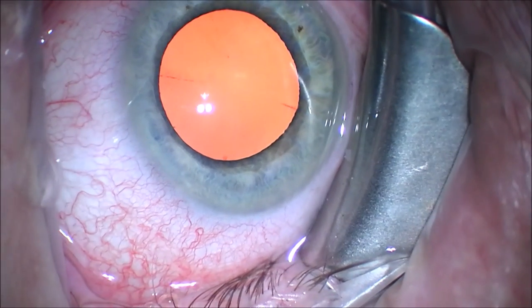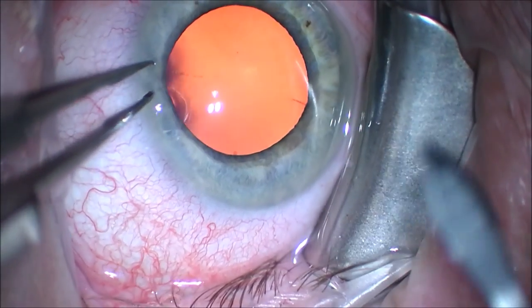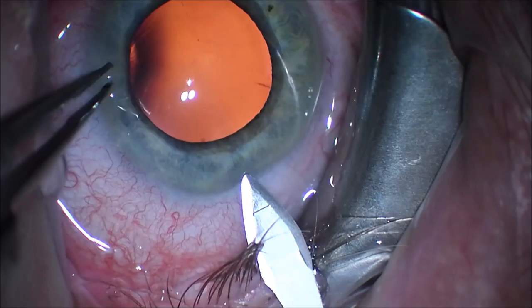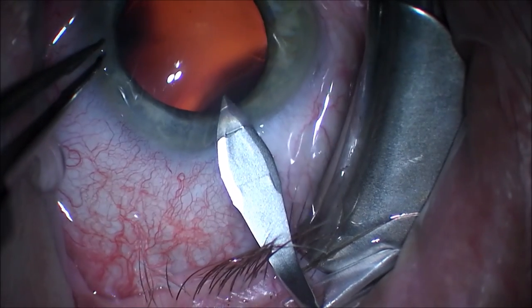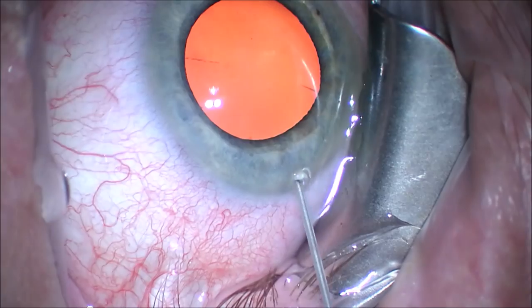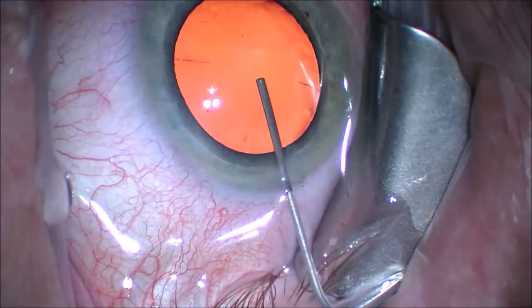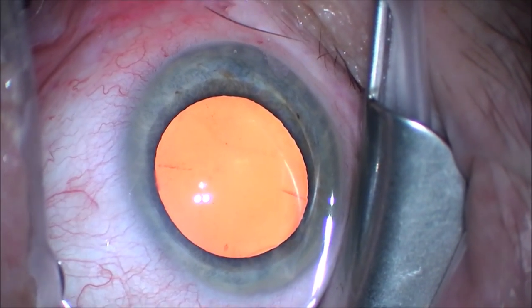You can see we make our typical sideport incision with a MVR type blade. We hold the eye through the paracentesis and make a 2.8 mm clear cornea incision with a keratome temporally, keeping the wound peripheral with usually a 1.5 to 2 mm tunnel. We then fill the anterior chamber up with a dispersive viscoelastic to keep space.